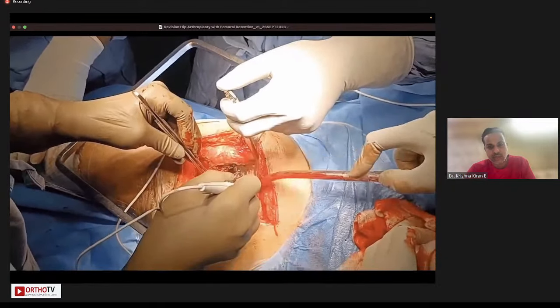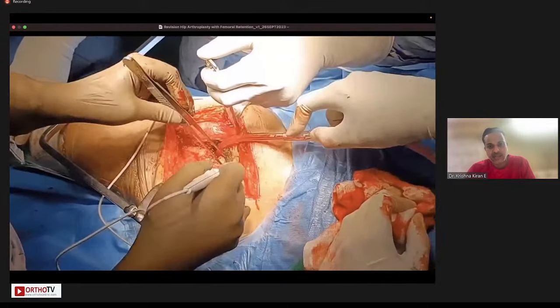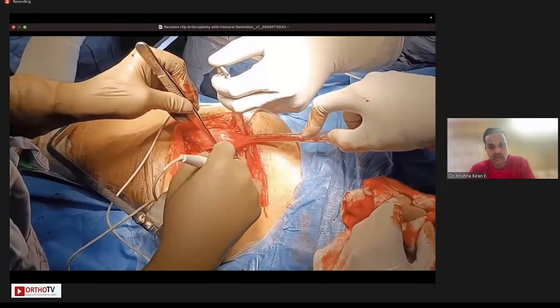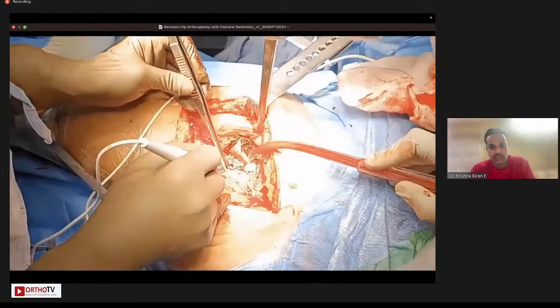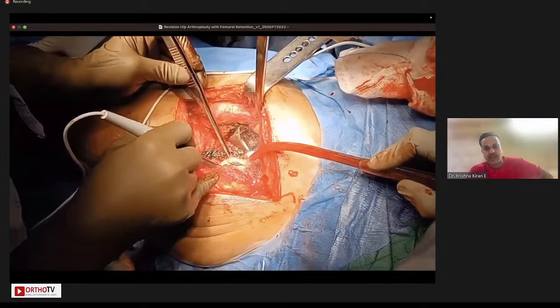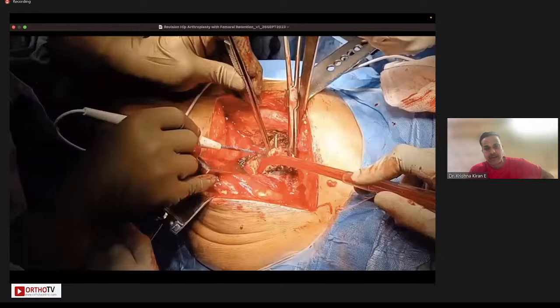And if you notice, I'm working inside the soft tissue flap at an angle which is tangential to the direction of the sciatic nerve. Sometimes we do not know the direction of the sciatic nerve. All this scar tissue and the polyethylene wear induced debris is being dissected. And you can see I'm working inside the flap and at a direction which is in the line of the sciatic nerve. It's not cut perpendicular to it.